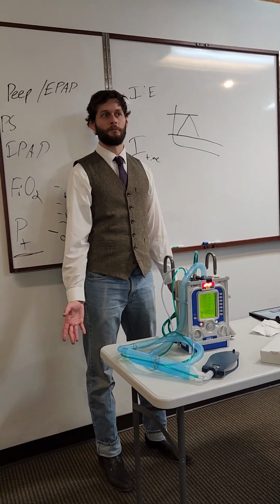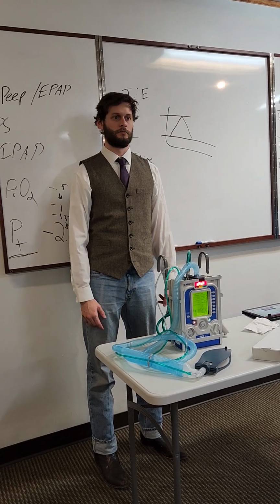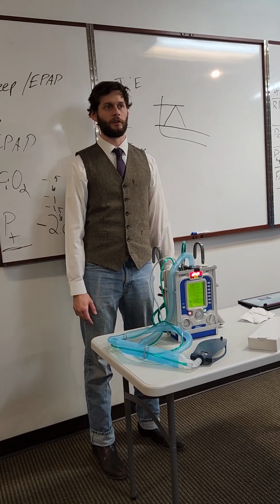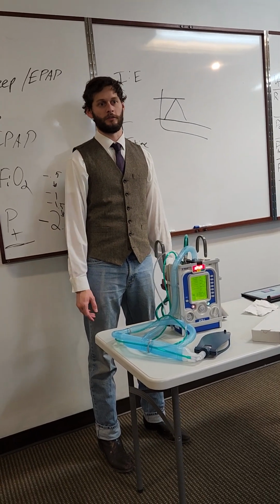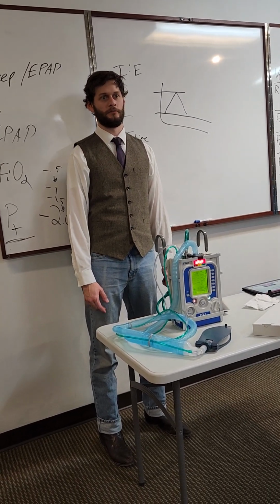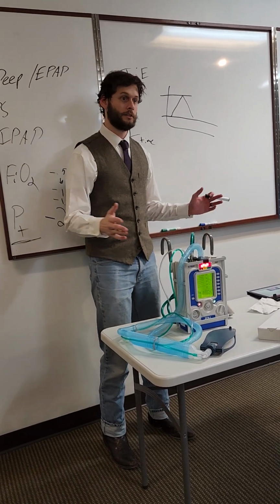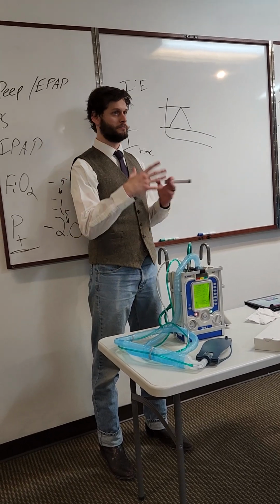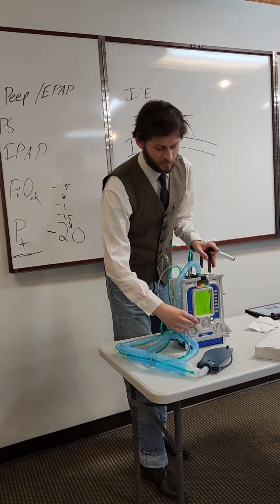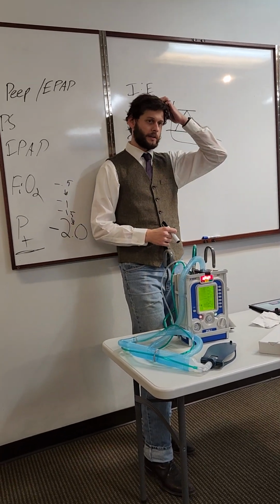With pediatric patients, you could have a 10-year-old that's 5'8", 250 pounds, or a 10-year-old who's 3 foot tall, 60 pounds. The variety is so massive that it's more ideal to worry about the pressure in their airways than to try to measure exactly what the tidal volume is. They don't fall into neat little categories like we have with adults.